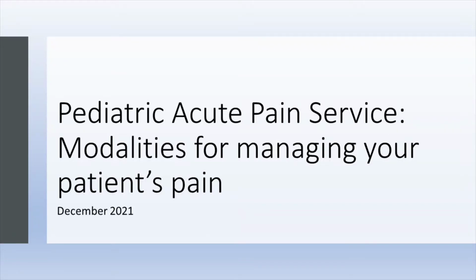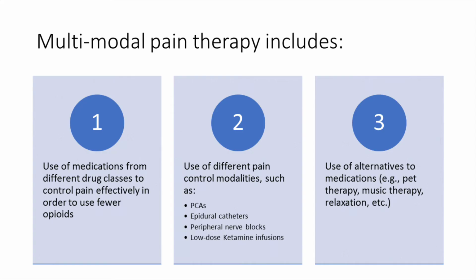During this in-service, we will review the pediatric pain team and the modalities they provide for pain management, focusing on the management of the patient with an epidural. The pediatric pain service team also provides services such as peripheral nerve blocks, PCA management, and low-dose ketamine. For more information on these, please refer to your e-learning assignment or policy stat.